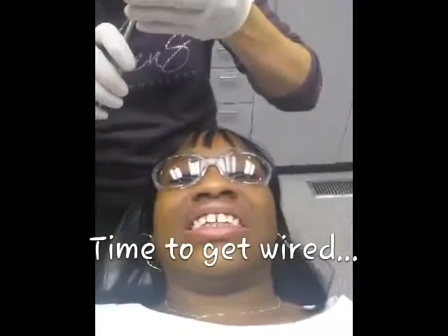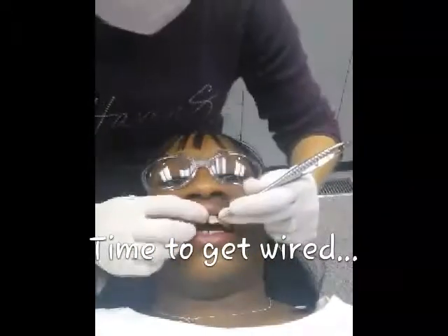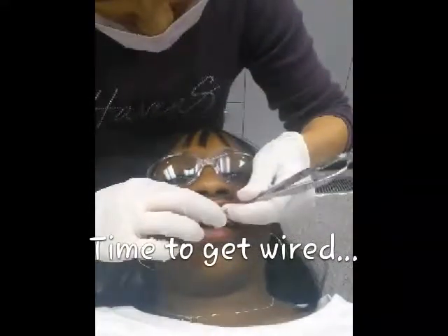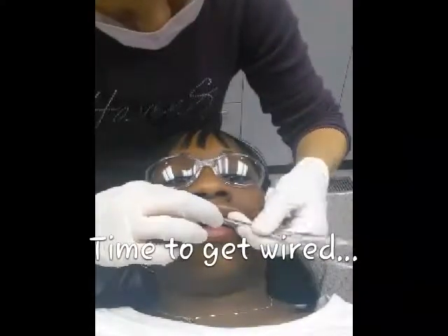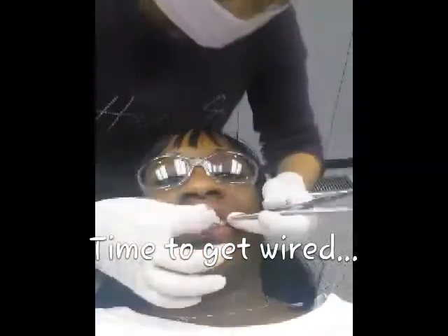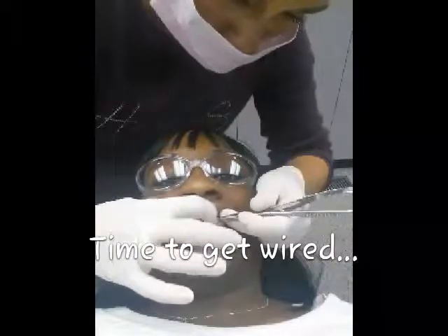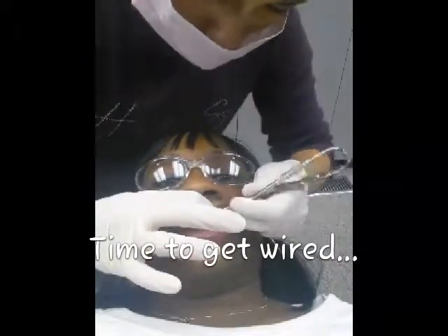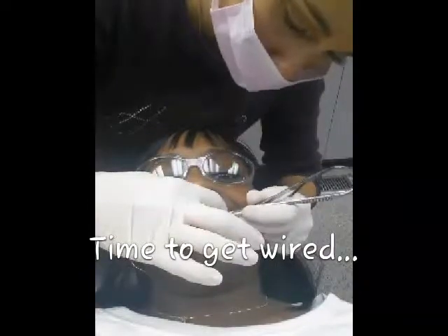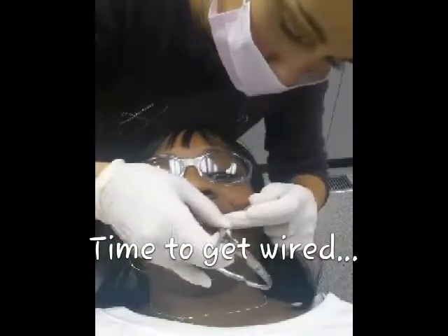So this is the wiring process. She places the wire in, and then she takes those bands. They're like really little rubber bands, and she places them around each bracket over the wire so that it holds the wire in place. And the thing about those is she asked me what color I wanted, and of course I didn't want the really colorful ones like the kids usually get. And she said what usually happens with the clear brackets, people usually either choose the clear rubber bands or pearl. And she pretty much suggested that I go with the pearl.